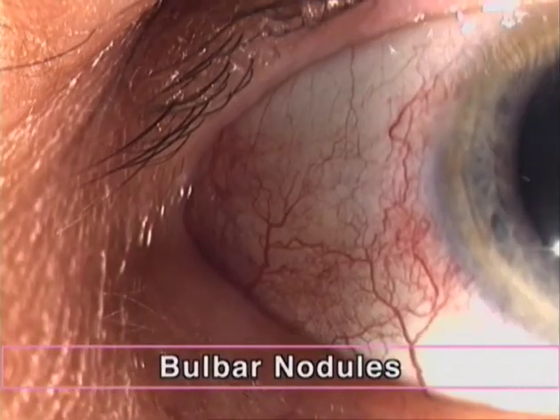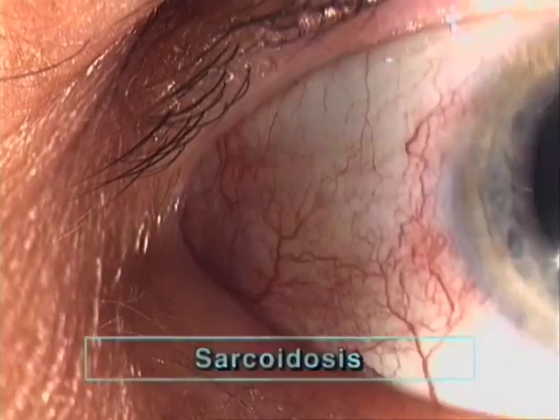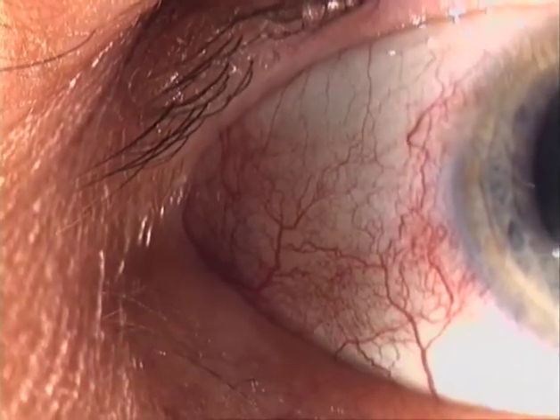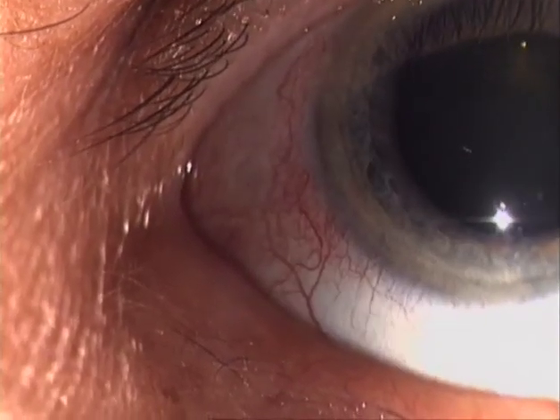Bulbar nodules. Follicle-like nodules on the bulbar conjunctiva, such as here in a case of sarcoidosis, are easily missed because against the white scleral background, whitish nodules are difficult to see.